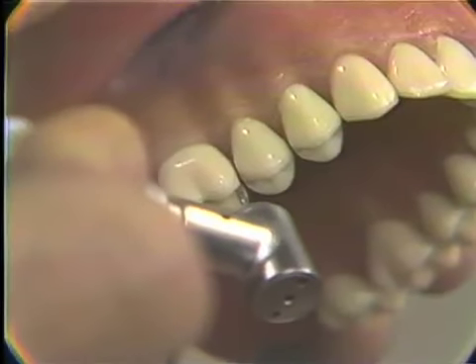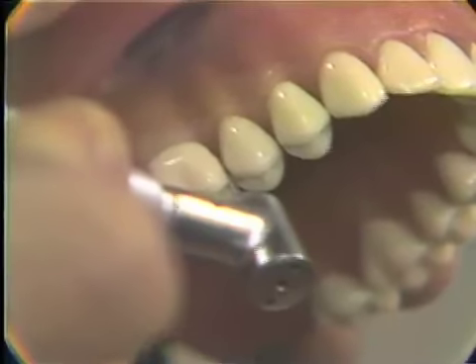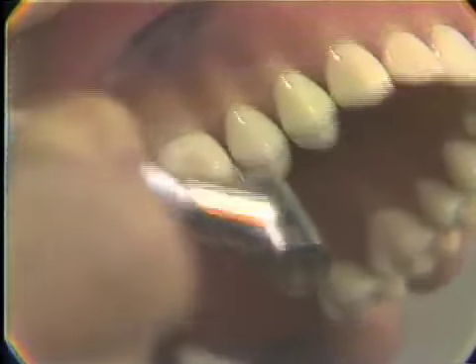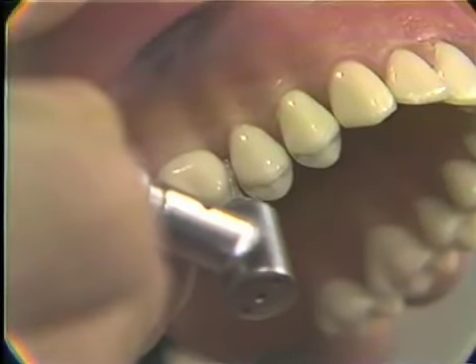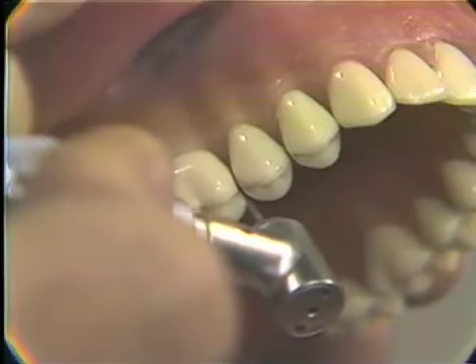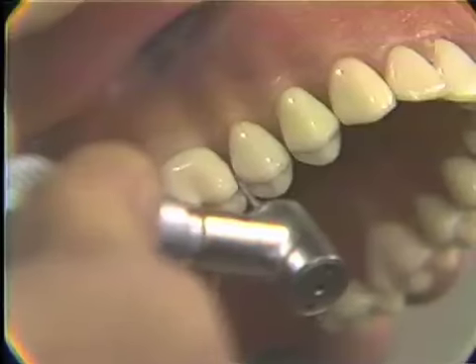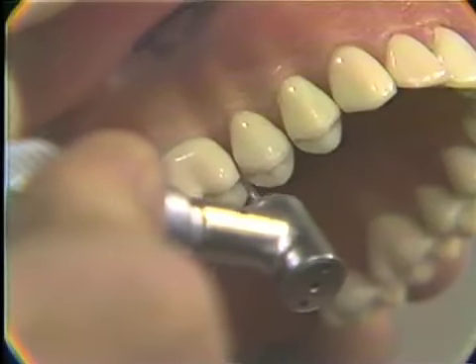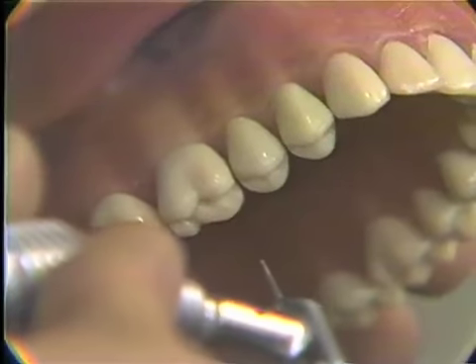If we were bringing this into immunity now, we would have to bring our diamond instrument out through this area, from the buccal or from the lingual. And as you can notice, it will not come out. The only thing that we can do here is to take off more tooth structure on the buccal or the lingual from the prepared cavity, or we will have a tendency to nick the other tooth, or to do both. So this is why we say that we have a conservative preparation with a slice.